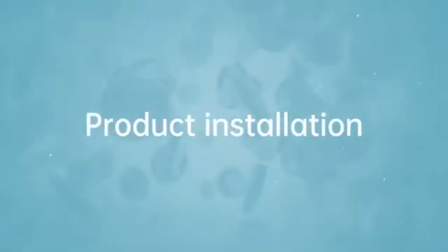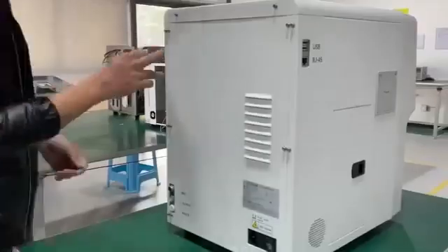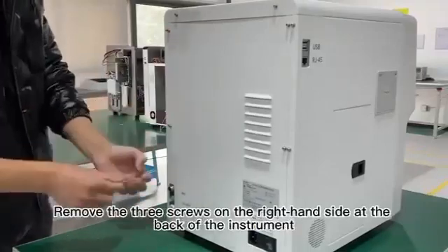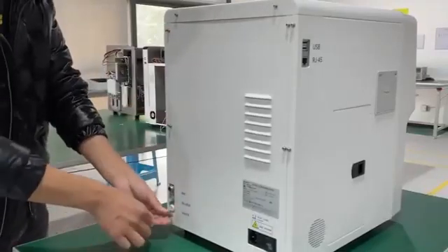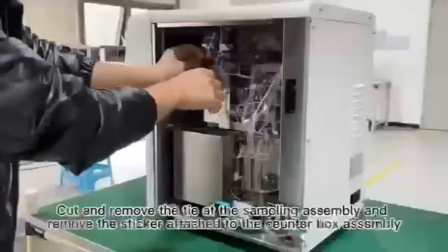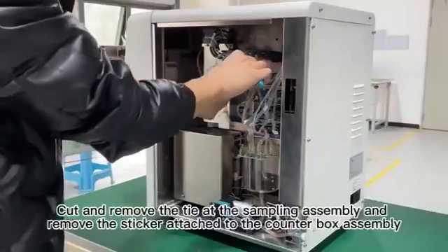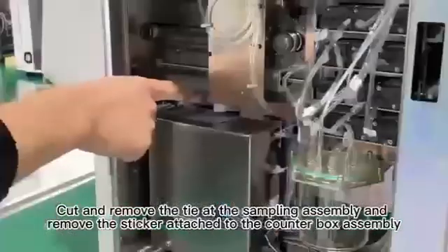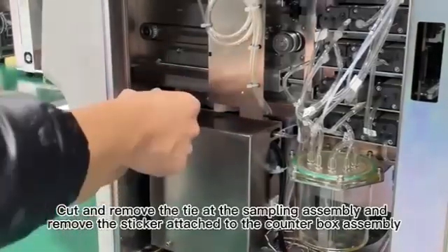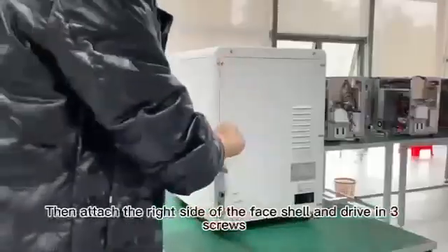6. Product Installation. Find the Allen key from the accessories. 7. Remove the three screws on the right-hand side at the back of the instrument, and then remove the right-hand side face shell. 8. Cut and remove the tie at the sampling assembly. 9. Then attach the right side of the face shell and drive in three screws.